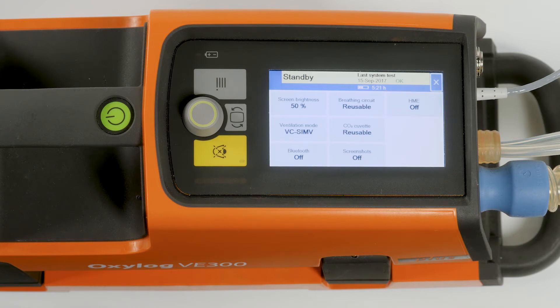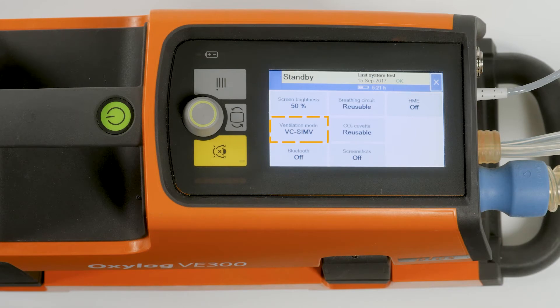The ventilation mode for the ventilation category Ventilation, displayed in standby mode as a pre-setting, can be set here. The options are VC CMV and VC SIMV.